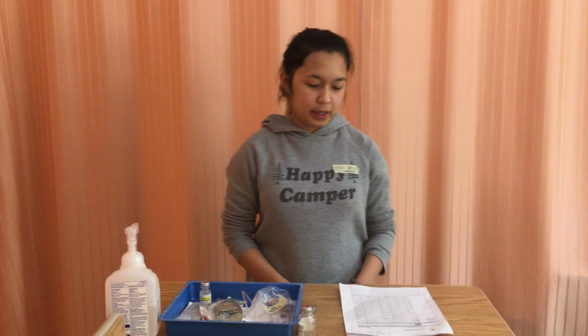Hi, my name is Rai Karasha and I'm a third-year nursing student. Today I will demonstrate how to reconstitute, dilute, and administer an IV medication via a mini bag.